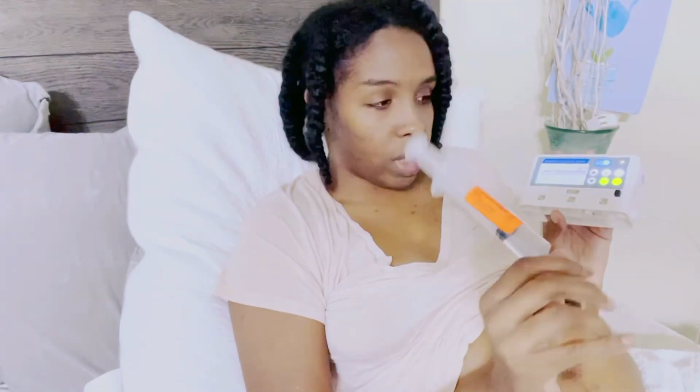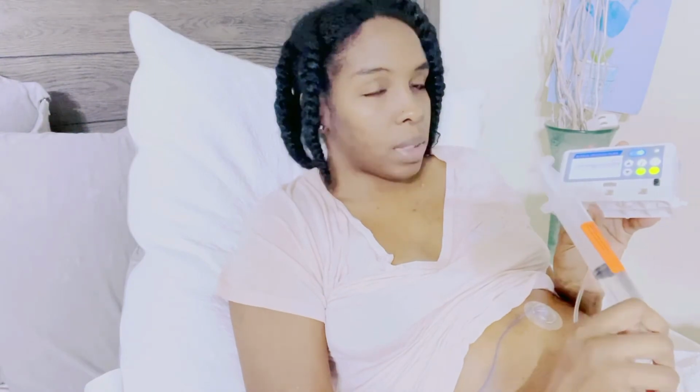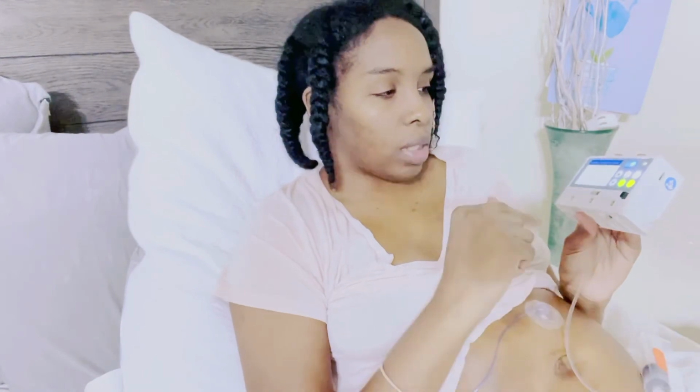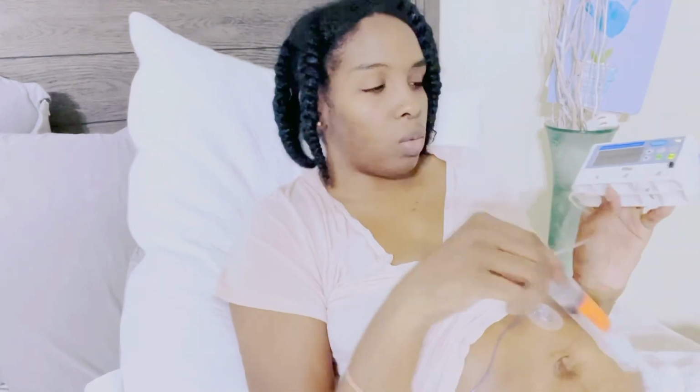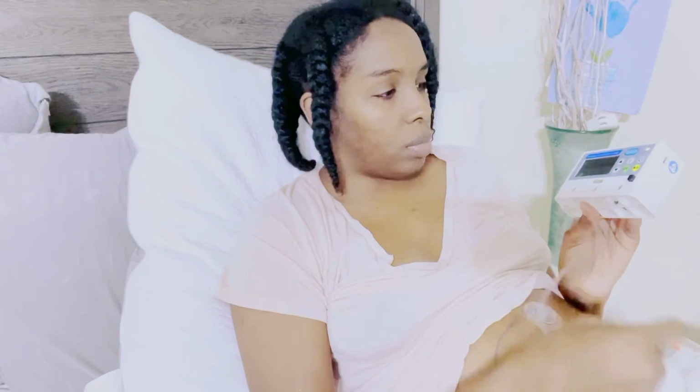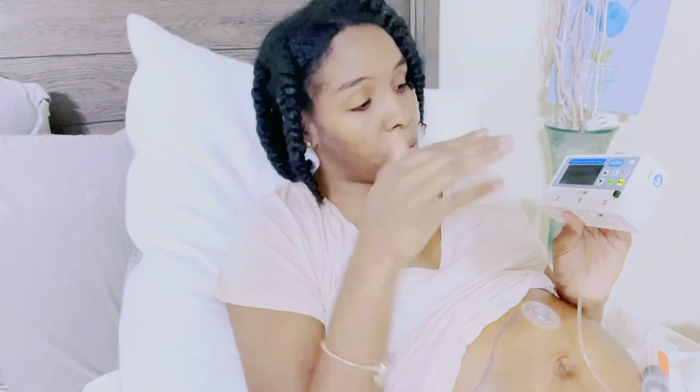And I have a big syringe because my machine kept sounding so much. I kept having so many problems with this machine. It kept sounding so much. It kept stopping, being clogged. So they gave me these big ones to help this machine give me my medicine more consistently. But I've had one issue after another. So hopefully after Thursday, I'll be real consistent with my machine giving me my proper dosage of medication so that maybe it will start to work a little better for me.